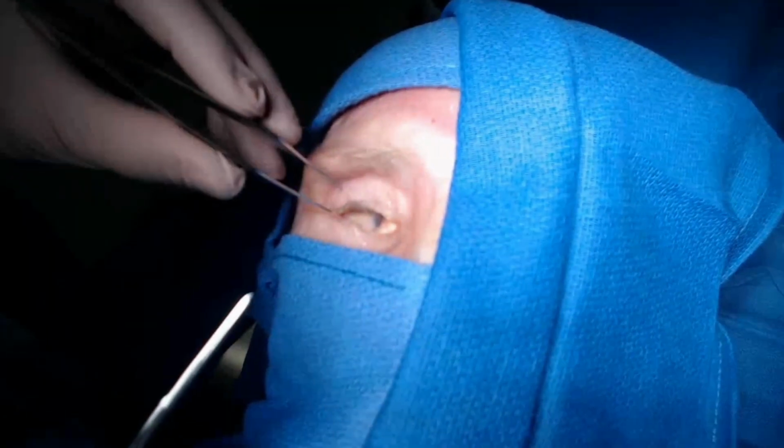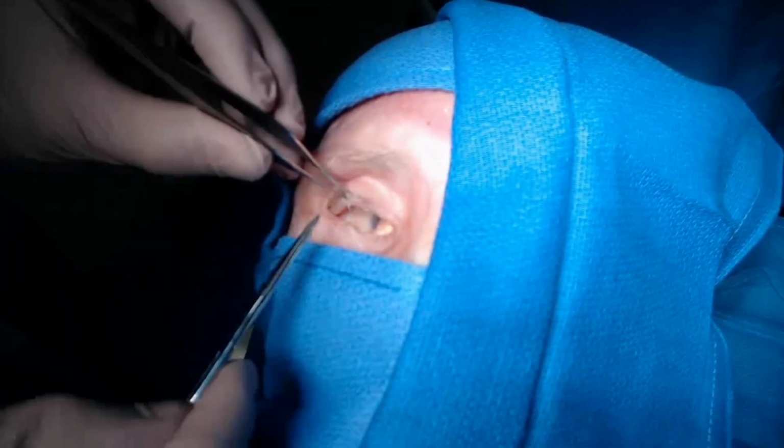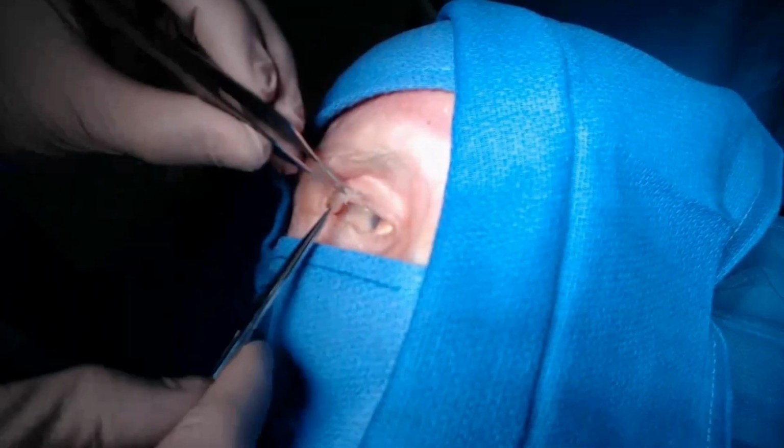Not shown in this video, the superior cantholysis can be performed in a similar fashion to further decompress the pressure within the orbit. In this second part, I will demonstrate an alternative vertical lid split method used to address orbital compartment syndrome. Here, the upper eyelid is retracted from the globe using forceps to avoid injuries to the eye. Alternatively, you could place the forceps backwards underneath the eyelid to ensure that there is no touch to the globe.